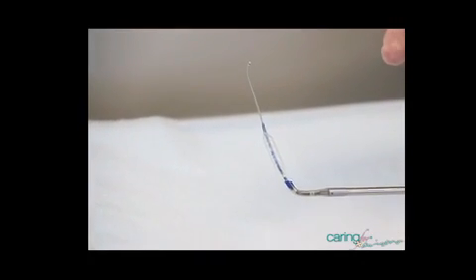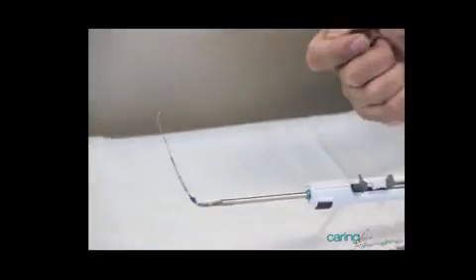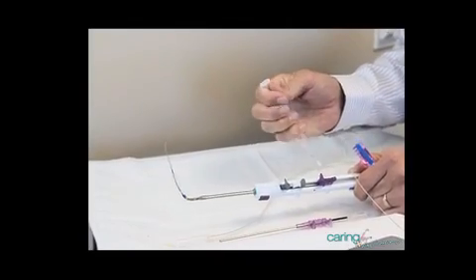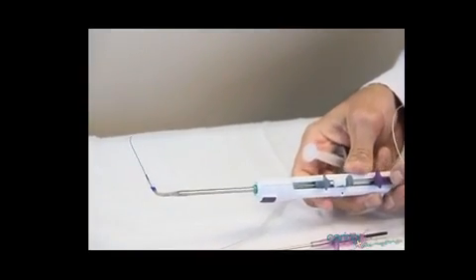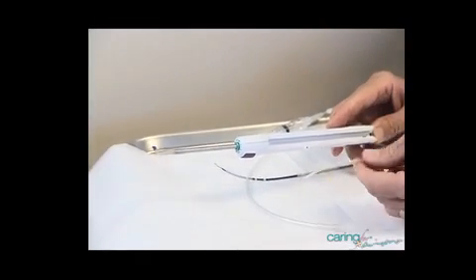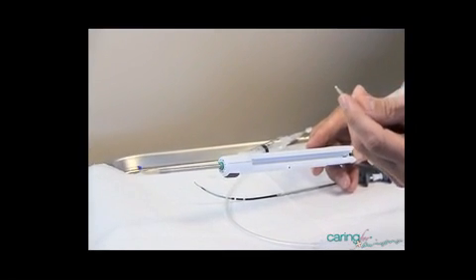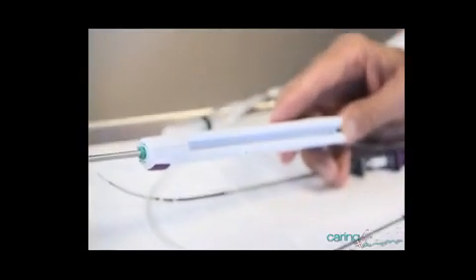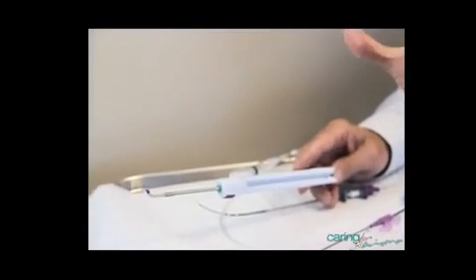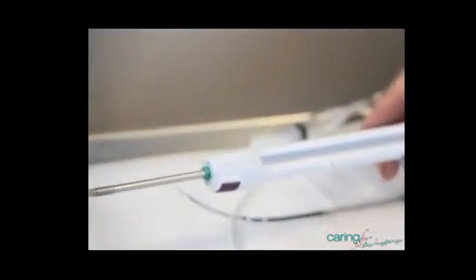Now, one question that patients often ask is, does the balloon stay in place? No. It's there just for a few seconds to dilate the opening to the sinus. We then deflate that balloon and withdraw it back into our guide. With our device here, we have a way of removing the balloon and guide wire and then placing in an irrigation tool. The irrigation tool is unique in that the tip again is soft, but there are also small ports here which may be difficult to see, but that spreads the irrigation out like a sprinkler, basically coating the whole inside of the sinus. So this is placed in the guide.